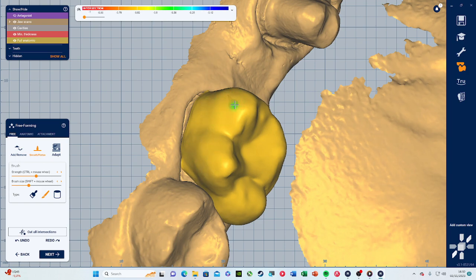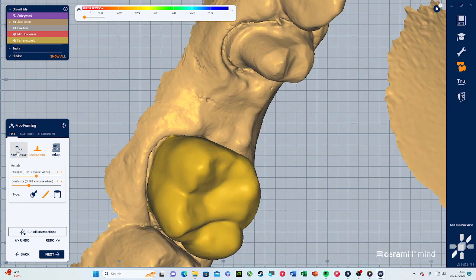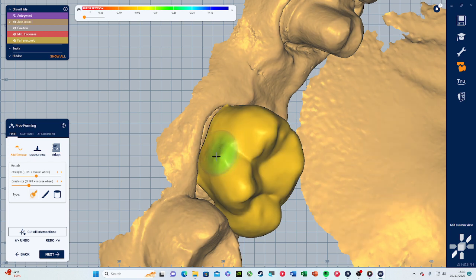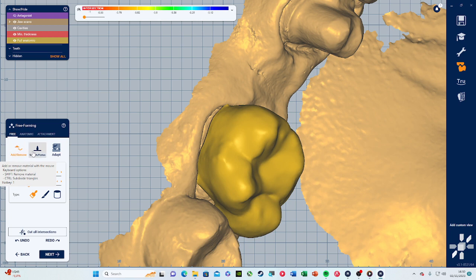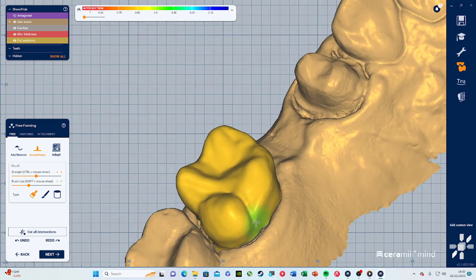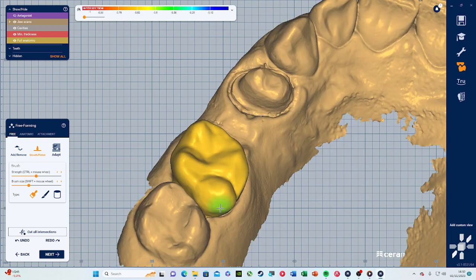To add material you just press and click; to remove you hold Shift. Let's say I add some here — or a bigger chunk like so. You would always need to smoothen it out afterwards. Don't play around with it too much or the crown will become too big. That's just to show the free-forming tool. Press next.